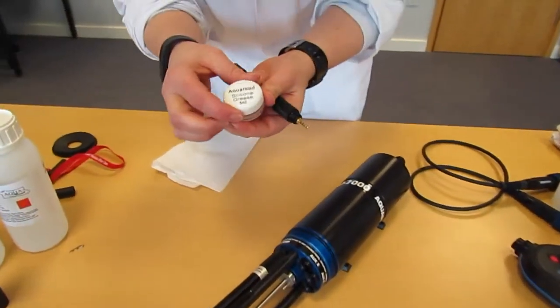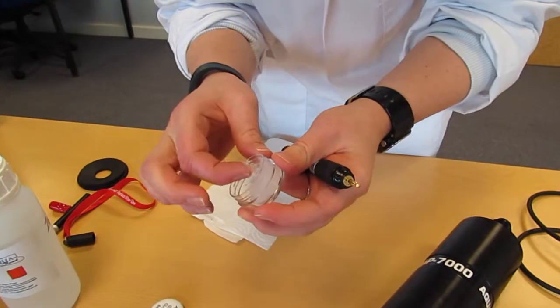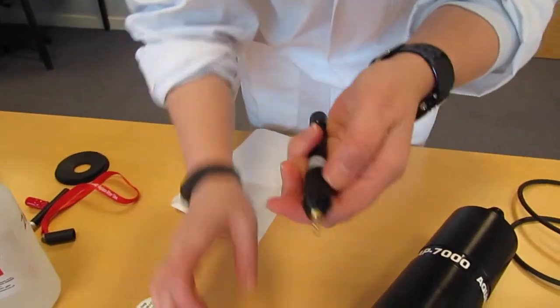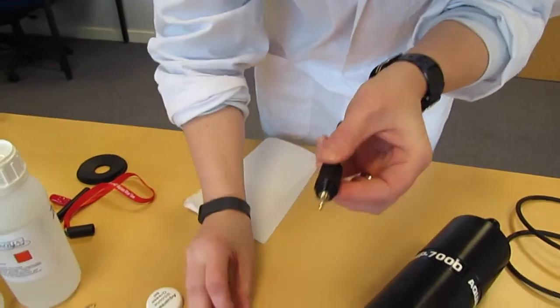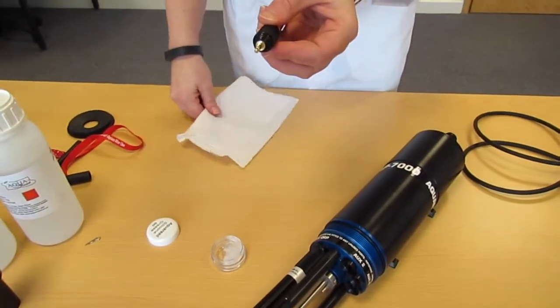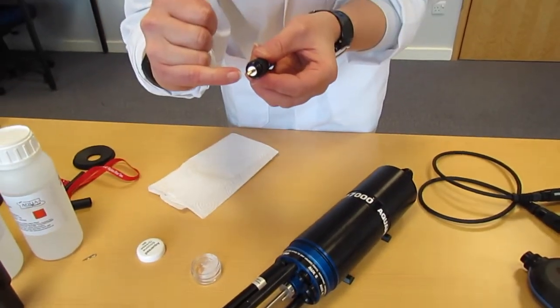We then take the silicon grease and apply a small amount to the black threaded part of the electrode, making sure that we don't get any on the gold terminal.